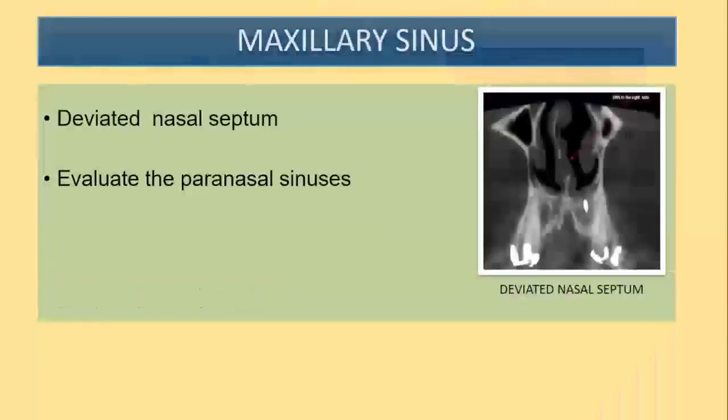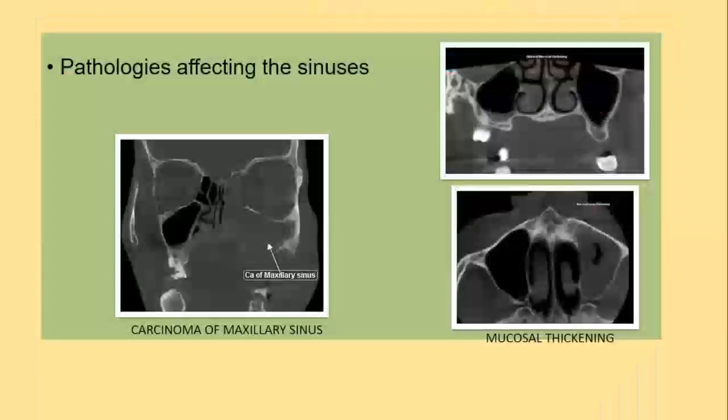Sinuses show you a lot. Just one point here: this is a sinus view, showing your coronal view of carcinoma of the maxillary sinus. I remember Shilika just asking me if something could be spoken on mucormycosis. Honestly, mucormycosis is just a pathology that causes extensive destruction of bone.